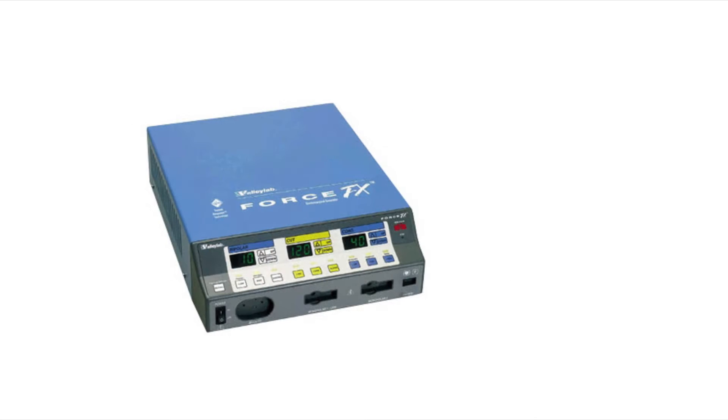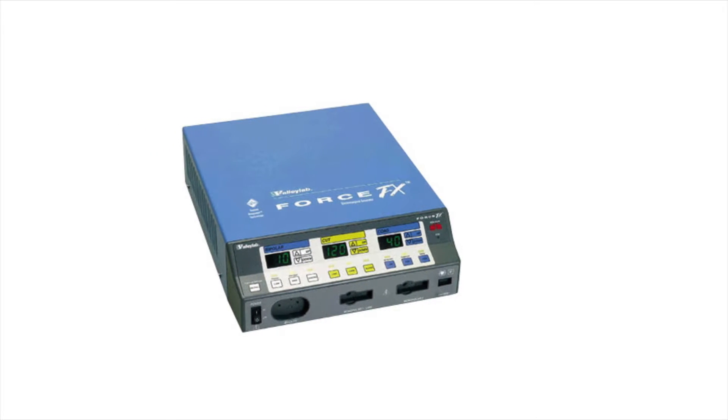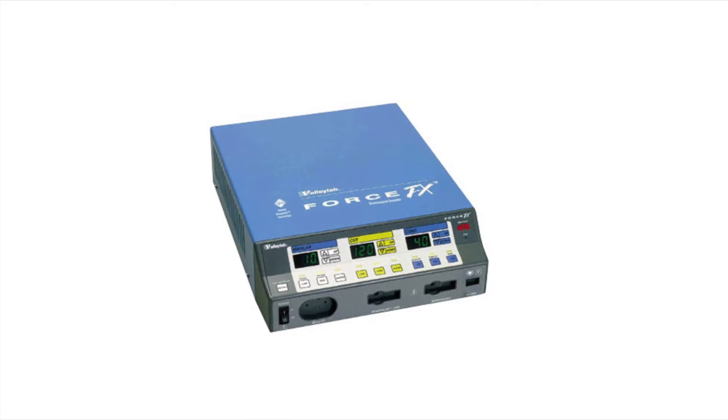The generator is activated by handset or switch controls. Receptacles are marked to ensure correct connection of the accessories.